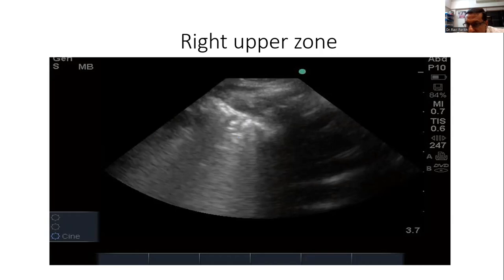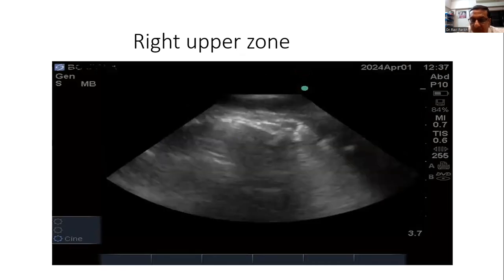Again, the underlying history and the clinical correlation, as you very nicely described, sir, gives us that information to suspect that this may well be a pneumonic presentation, maybe an aspiration pneumonia, maybe infection, a little bit late postoperatively to have it. And then the next image, again, if we could just have a look, this is a very nice fractal sign.